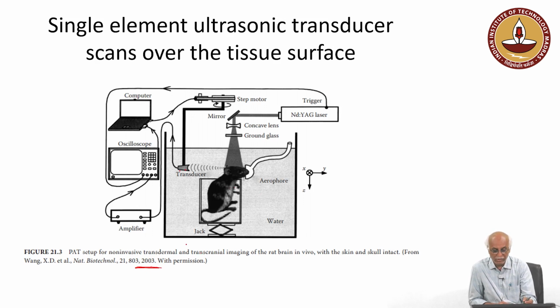Lots of improvements have taken place, but basically the idea is to capture this acoustic signal from different directions. So, you can have a transducer which rotates all around.